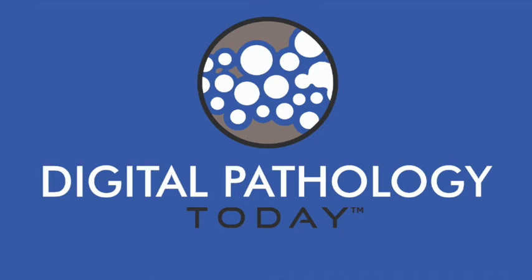Oh, absolutely. But back to your earlier point of the pathologist who's on their own out in a rural area, we actually have those situations now. And that's where digital pathology can help them today. All they need to do is put that slide on a small scanner and make a phone call, and our other consultants are on the phone with them, able to provide assistance right now. So that's the application that's out there today and absolutely working.